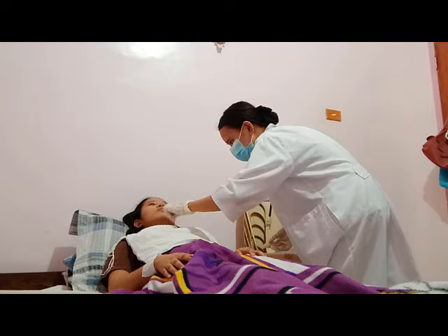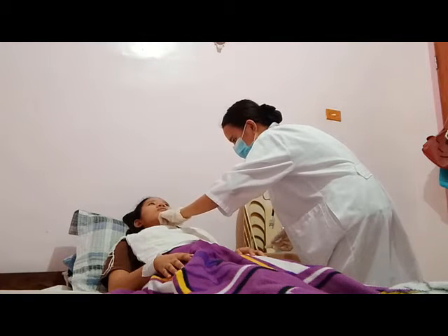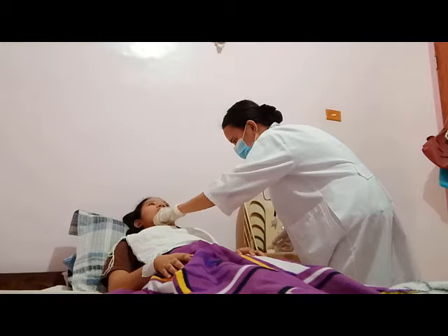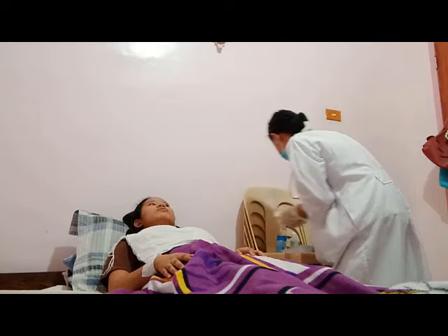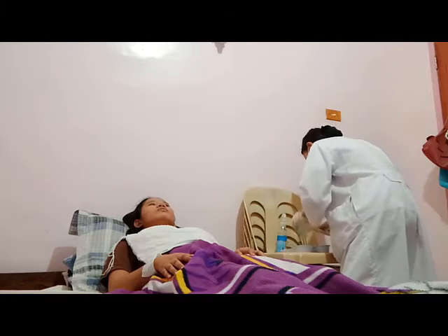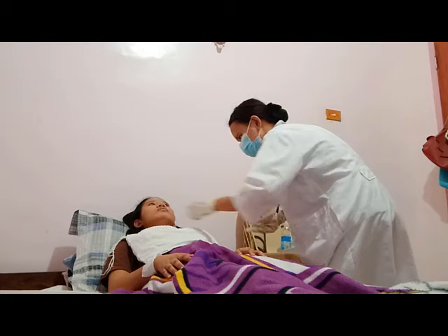Dip a cotton-tip applicator or gauze sponge in a cup or basin with sterile saline and clean the stoma site. Use each applicator or sponge only once, moving from the stoma site outward.